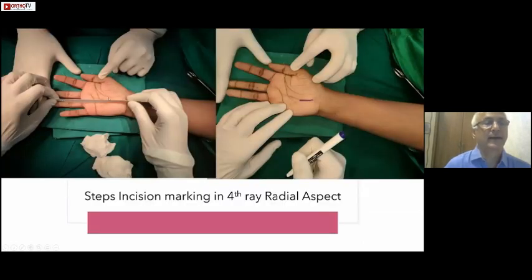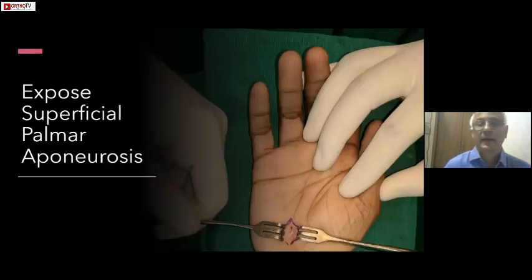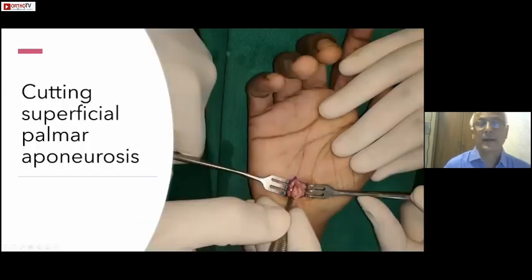Basically, we take an incision on the radial aspect of the fourth ray and we mark it so. First, we cut the dermis and the fat. Then the superficial palmar fascia is exposed. Then we create a plane between the aponeurosis and the subcutaneous tissue, both proximally and distally, as you can see here. Then we cut the superficial palmar fascia.